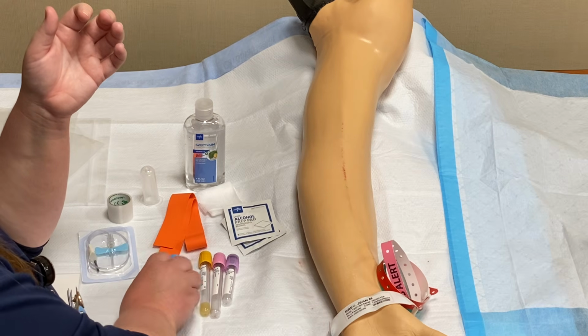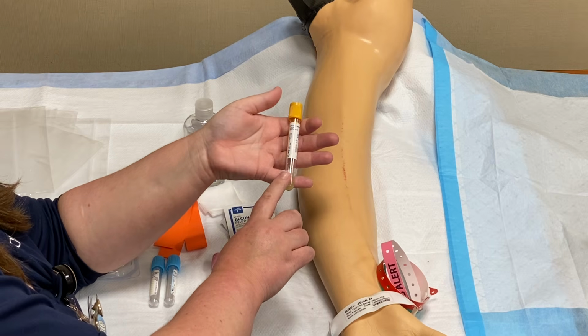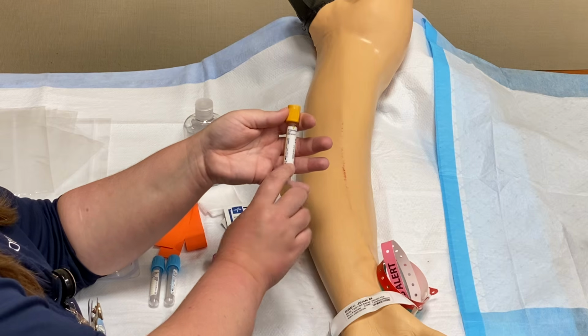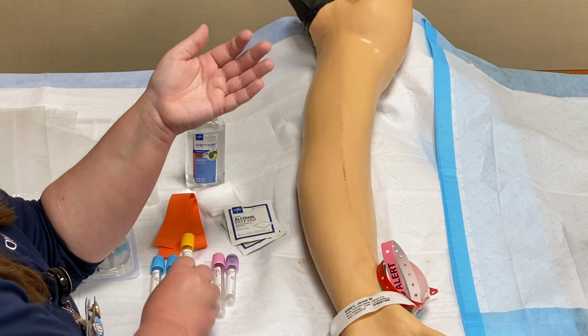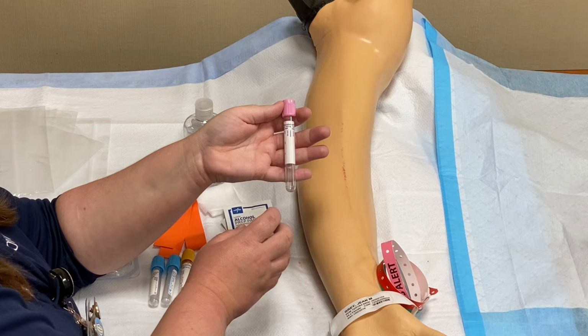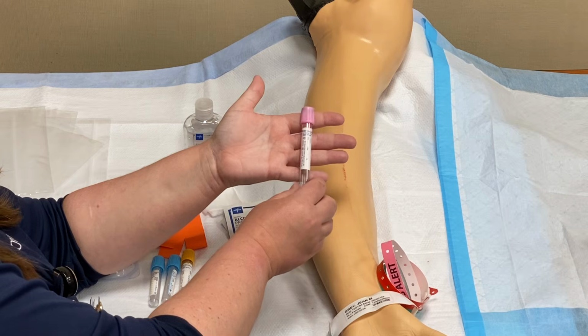I'm also running a BMP, which is a basic metabolic test, which is my gold tube. My gold tube holds 4 mLs at max. The minimum amount is 1. I have my pink tube for my type and screen. This tube holds 6 mLs. The minimum amount needed is 5.